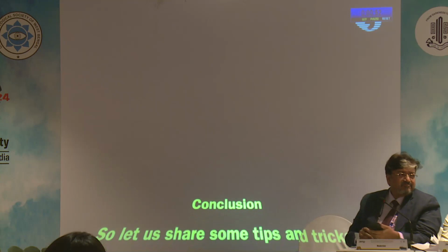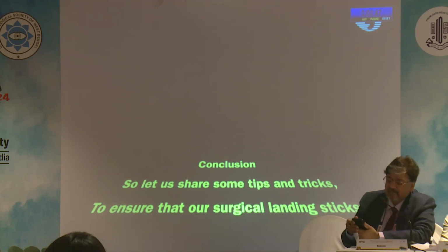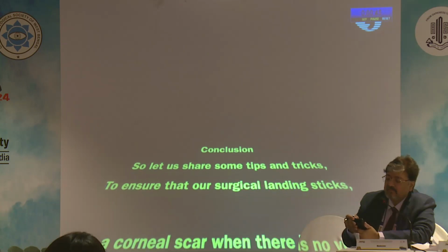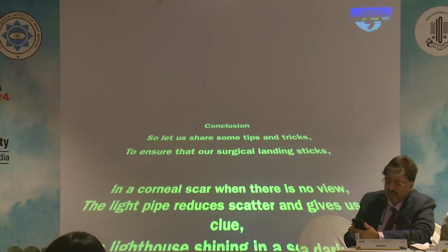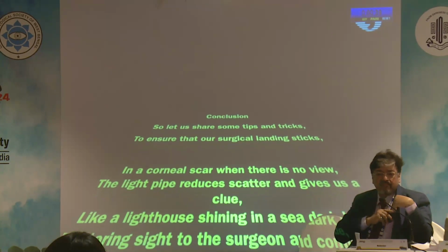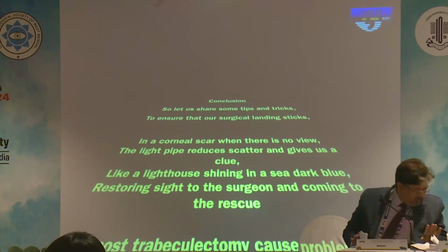So let us share some tips and tricks to ensure that our surgical landing sticks. In a corneal scar, when there is no view, the light pipe reduces scatter and gives us a clue, like a lighthouse shining in a sea of dark blue, restoring sight to the surgeon and coming to the rescue.